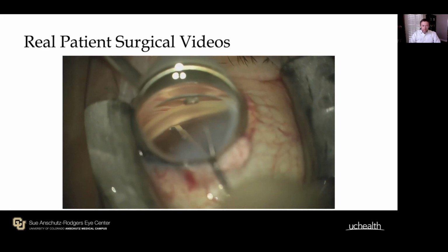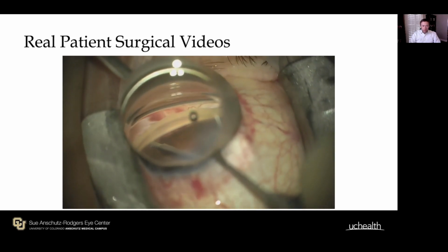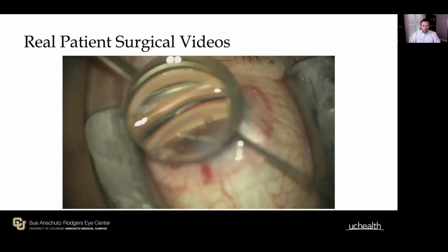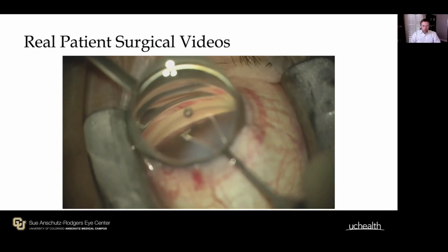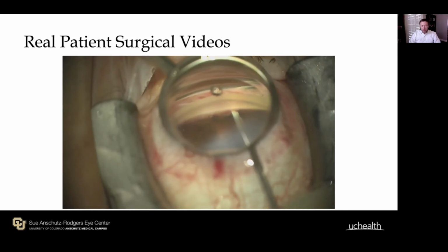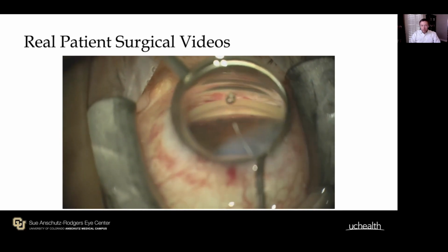Now in this case, you could see I'm starting out okay with a little bit of outward pressure, but I continue to push a little too far. Now the eye is rotating. This is a good example of too much outward pressure. But when I reverse and go from a backhand motion, you can see the eye stays nice and steady. I'm seated a little bit better, not pressing too far outward. The eye should not move like this.